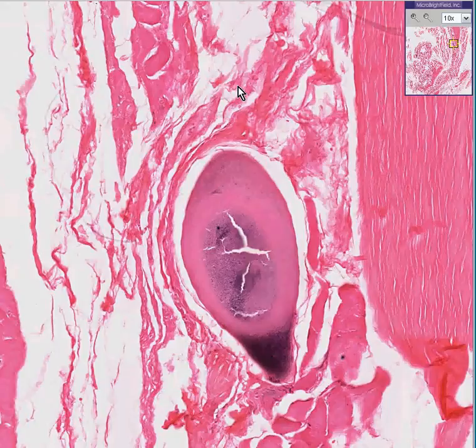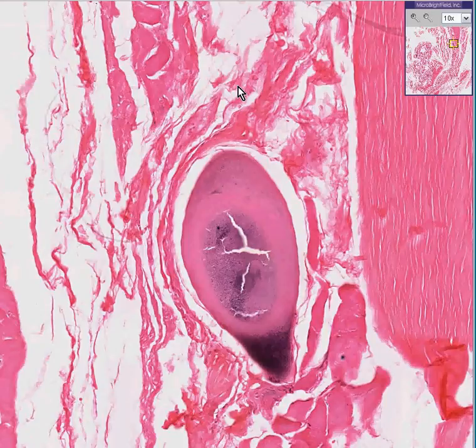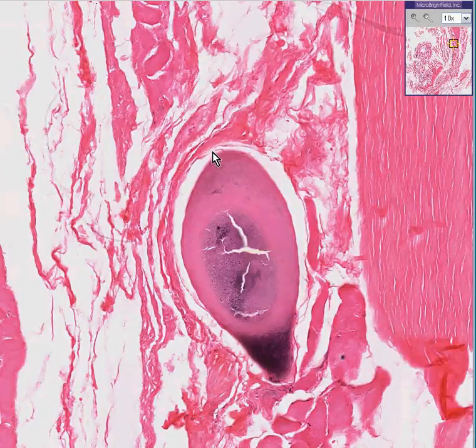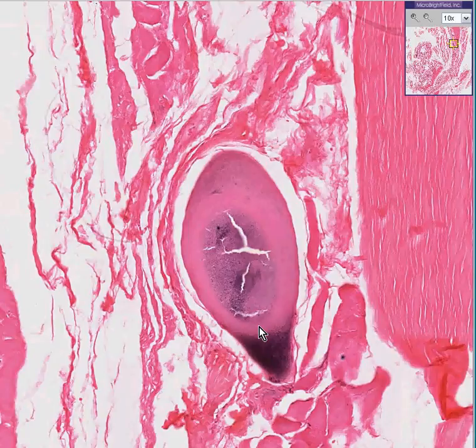Even though this organism has a complex life cycle and various forms within the body, these are what you might find in skeletal muscle: calcified oval cysts encysted within skeletal muscle.